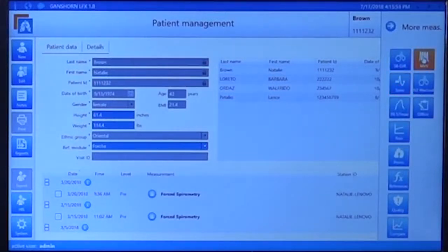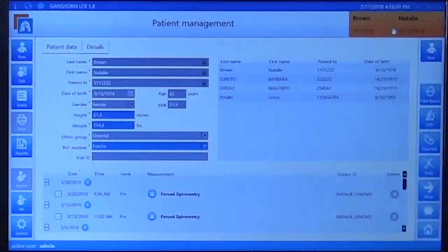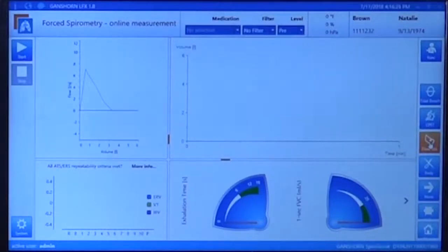So if we want to do a new test on FVC, just click on flow volume. The machine automatically will measure the environmental conditions and will open the new part of the software. The parts that we have here: the flow volume curve, directly as you will see with the predicted value. You will have also a volume time curve in real time, your testing validity on the lower left hand, and the incentive screen on the lower right.